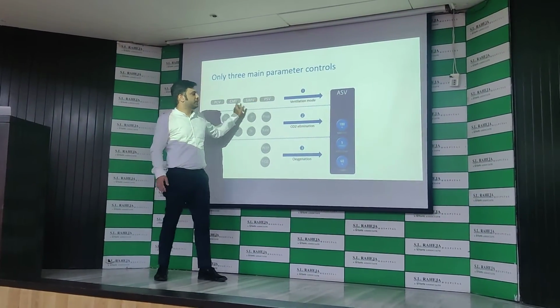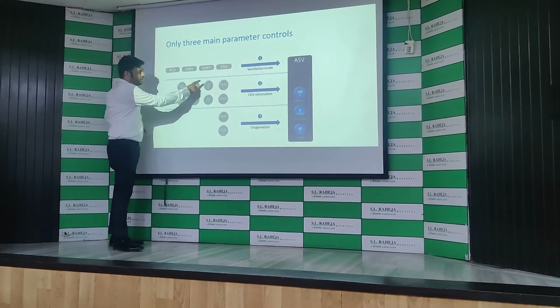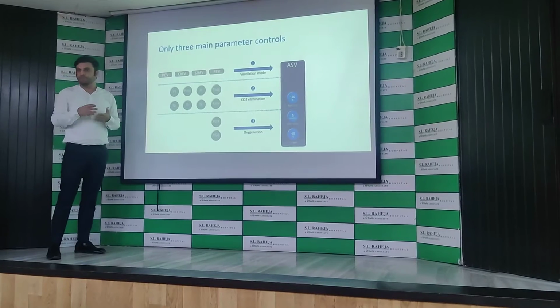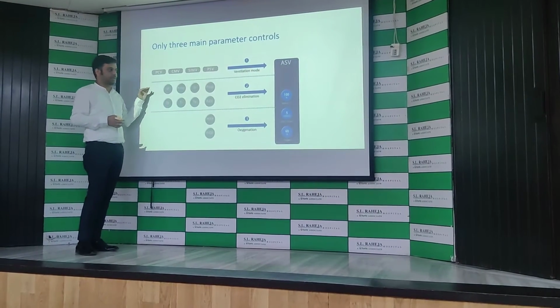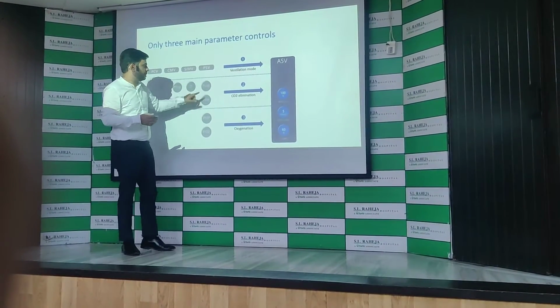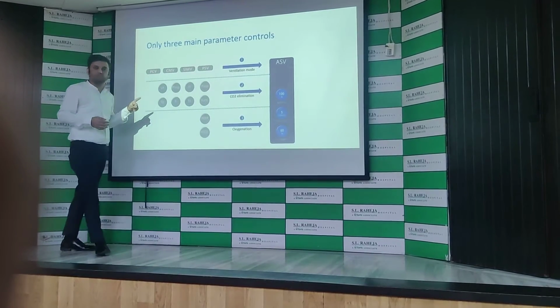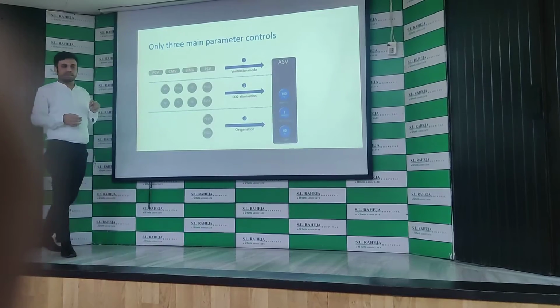Now for all this we have one ventilator mode, which is ASV. All these parameters, specifically the volume, the rate, and the inspiratory time or I:E ratio that we set, ultimately help us eliminate the CO2. In ASV, instead of setting all these parameters, we set just one parameter, the percentage minute ventilation, which ultimately helps us with CO2 elimination.